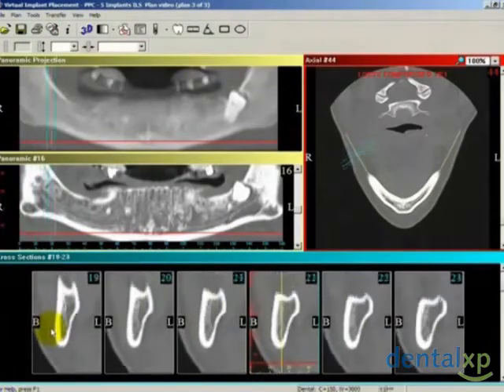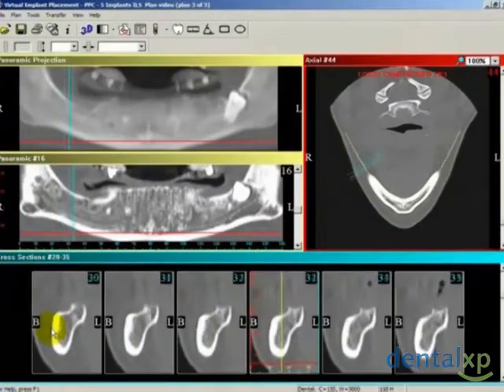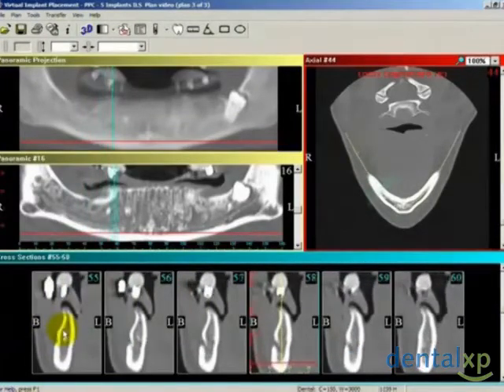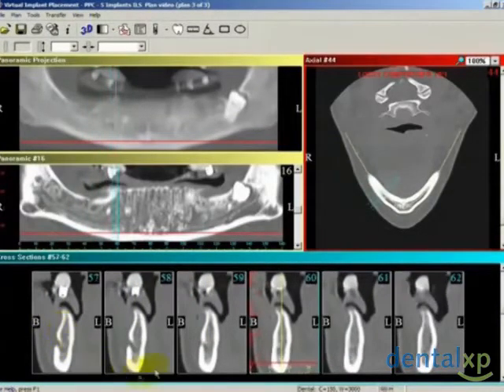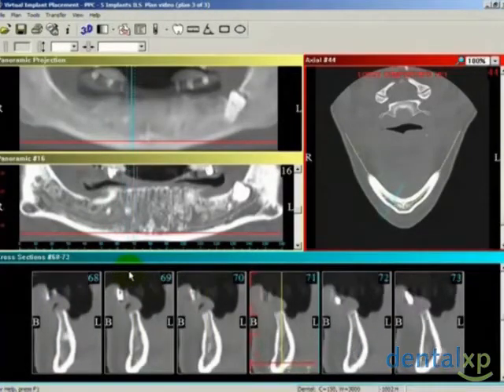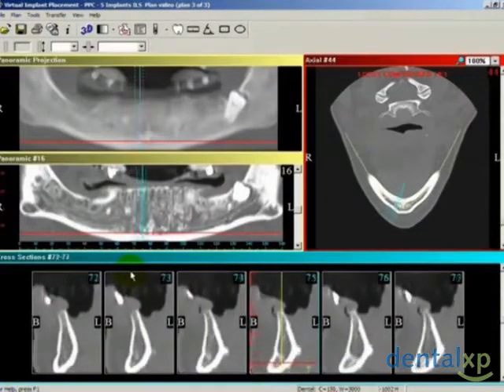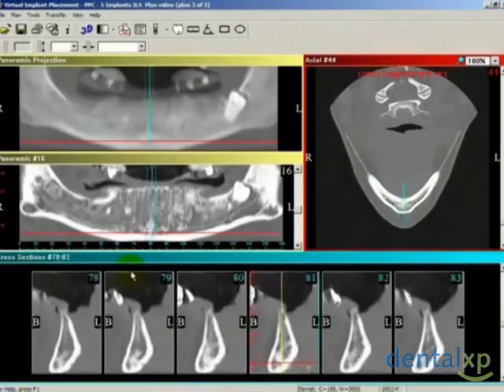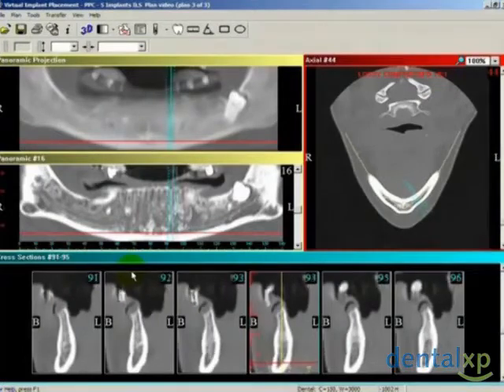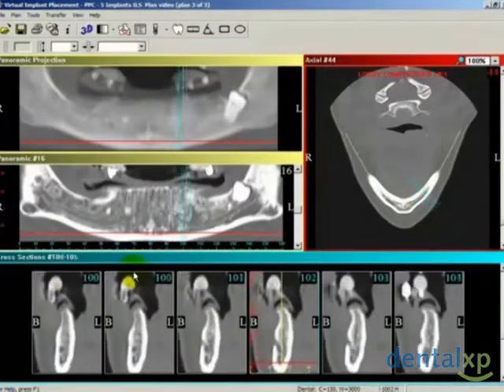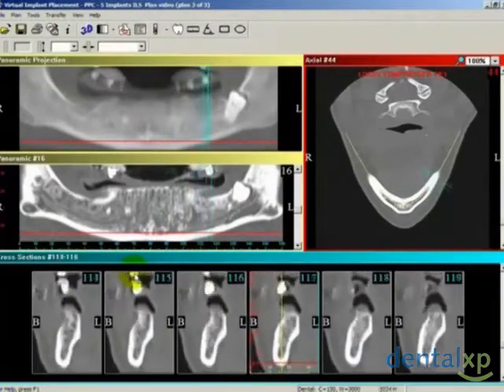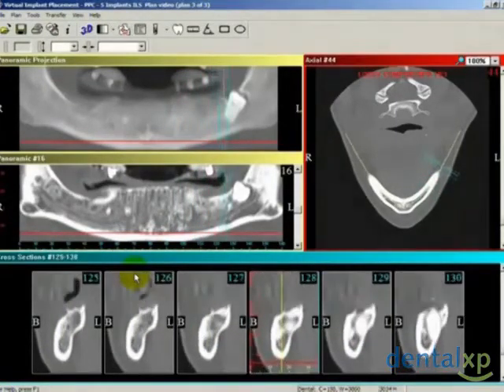Whichever CT panel we are scrolling in — whether panoramic, cross-section, or axial — you will see that panel's color line track the movements in the other two panels. Here we see the set of blue lines following our positions with respect to the panoramic and axial fields. The cross-sections clearly show the patient's mental foramen, as well as the condition of the ridge and buccal and lingual cortical plates. The area between the mental foramen is of particular interest, as the implants will be placed in this anterior region.